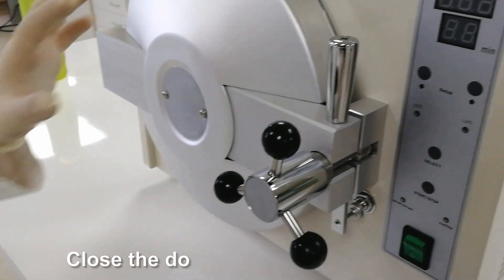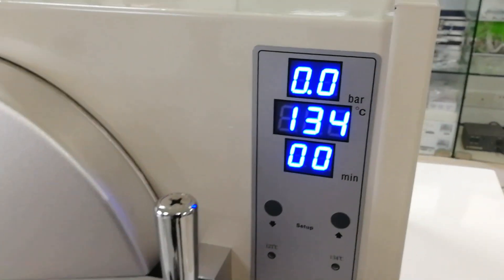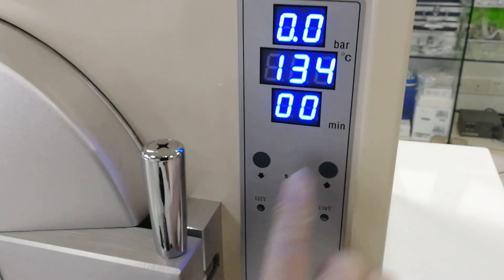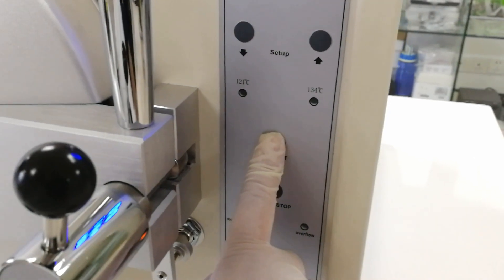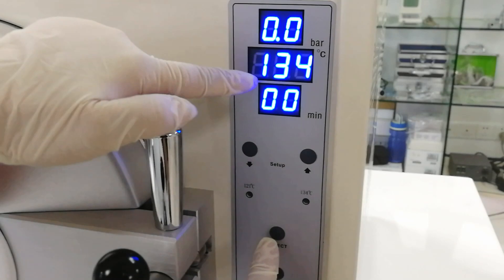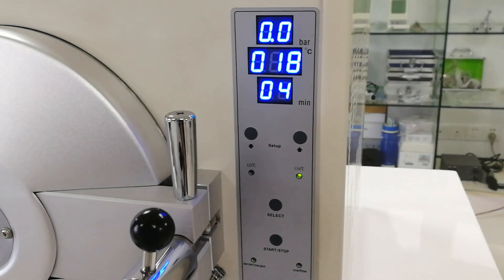Now we start the machine. Press the start button and the autoclave begins to heat. We can select different temperatures — 134 or 121 — according to the user's needs. Then make it start. Now it starts to heat.